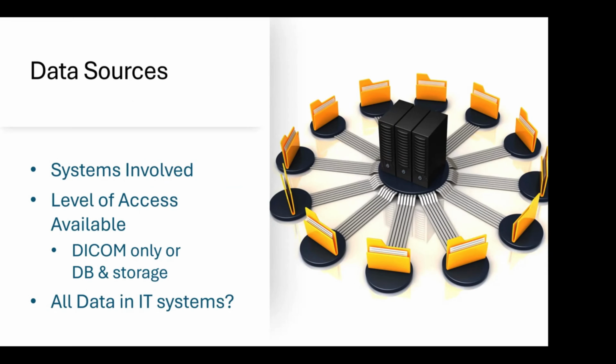Some data migration service providers have developed tools and methods to extract metadata directly from the source system database and the data directly from the storage. They might call this a direct connector or something like that. They'll have different terminology. What this allows them to do is they're basically bypassing the DICOM service, application service. They're extracting the database, extracting the files, and then using the database to update the files as they migrate that data. It's essentially doing what the source PACS system does when you make the request through a DICOM retrieve.